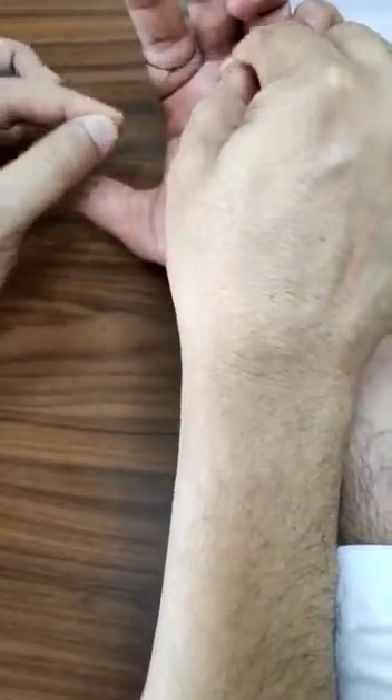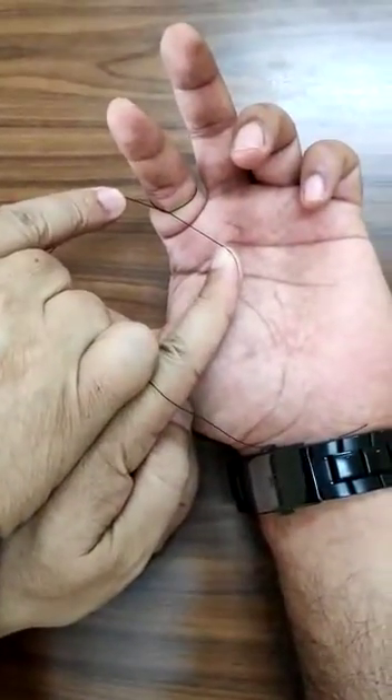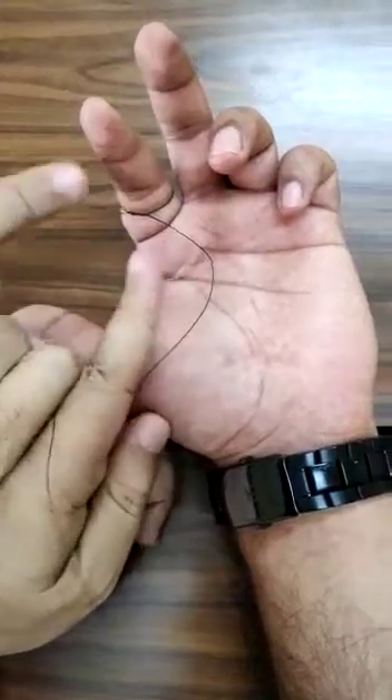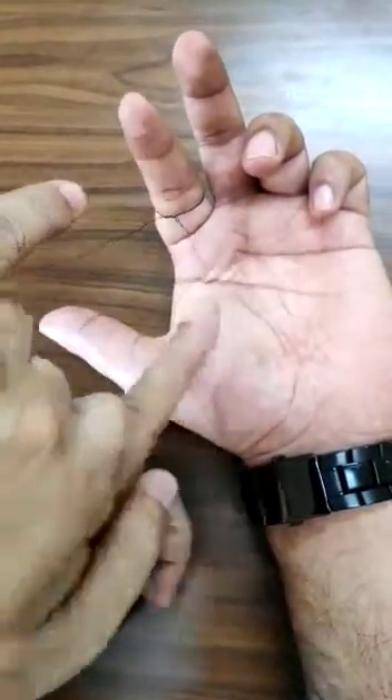It has become loose because it is not square. Now to make it square, you have to cross your hands here — now it is square. You can do it this way also. It is the way you pull a knot which makes it square or unsquared.